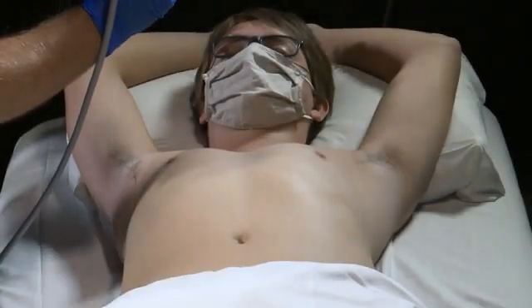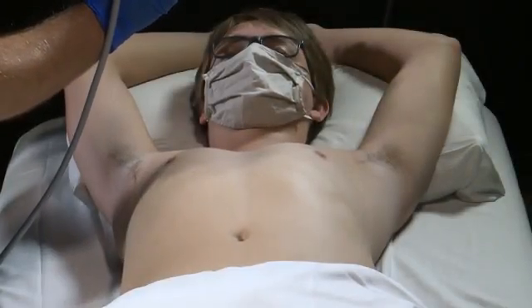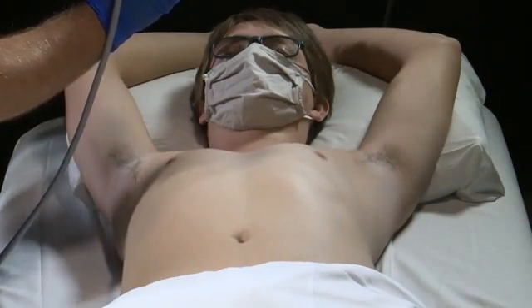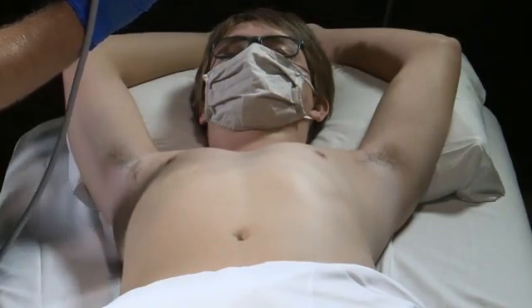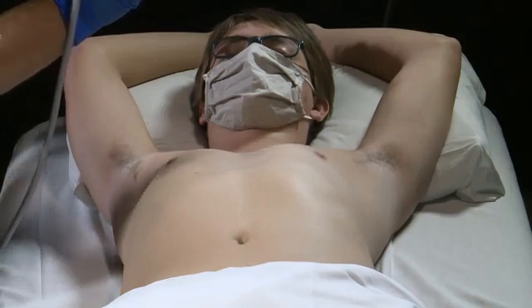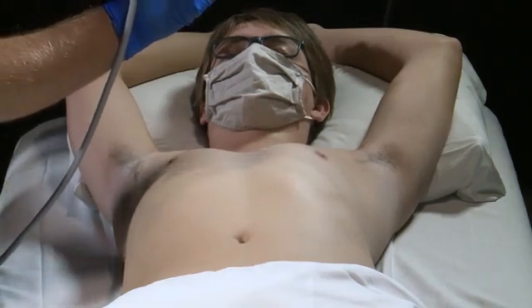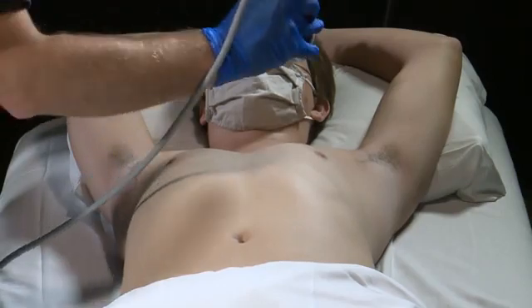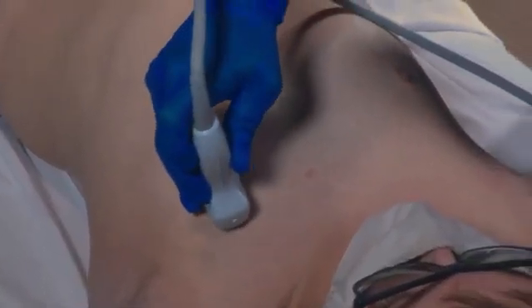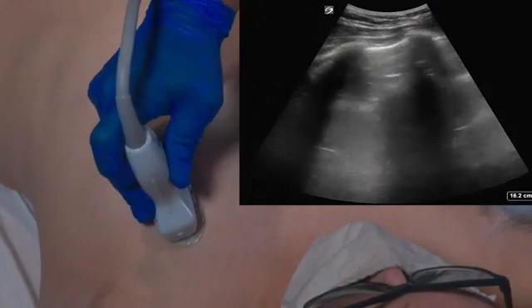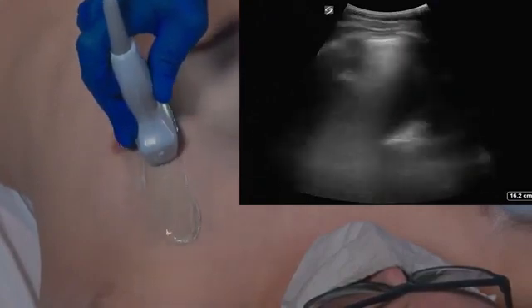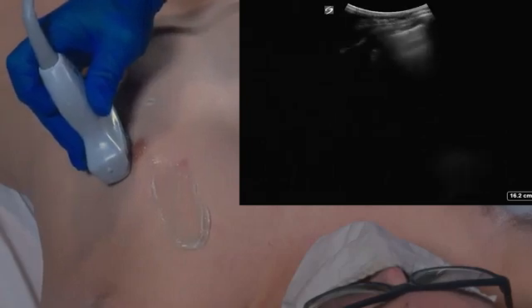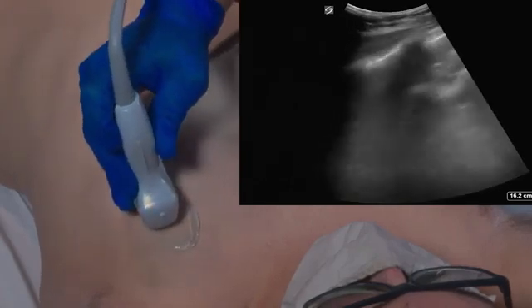For lung ultrasound imaging protocol number three — the anterior lateral posterior protocol, otherwise known as Lichtenstein's protocol — we're going to look at the anterior, lateral, and posterior chest. To do this, we'll place the transducer in the anterior portion of the chest and drag all the way down, investigating this entire area for any evidence of B lines.